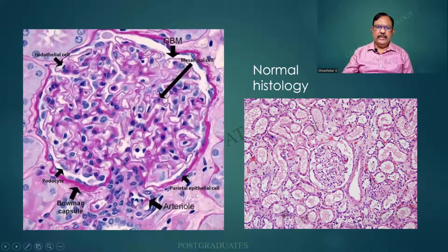But then this is a higher magnification of the glomerulus, which is a tuft of capillaries that is trying to filter the urine, which is an ultrafiltrate of the plasma. And in each of the capillaries, I told you that there is something unique. You have got an endothelium and an epithelium, which is separated by a basement membrane. And this originates from the mesangium. Externally, we find the parietal space or the Bowman space.